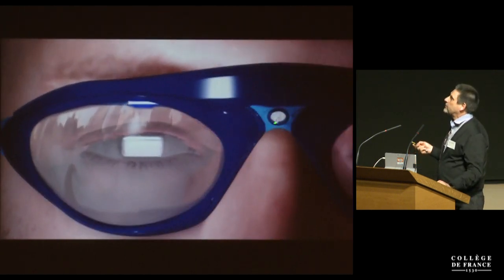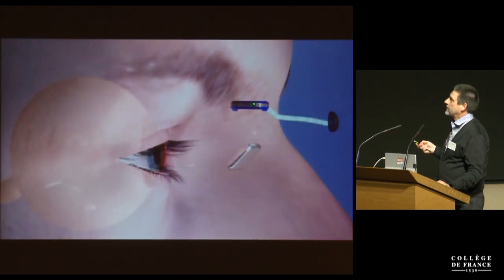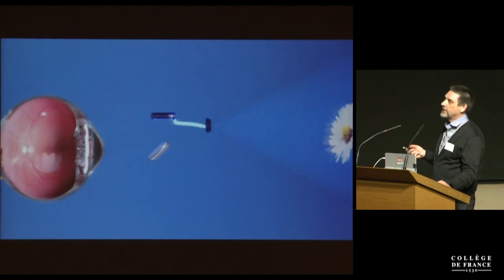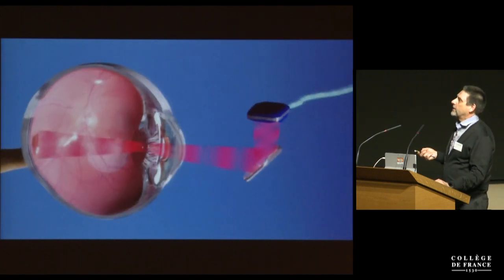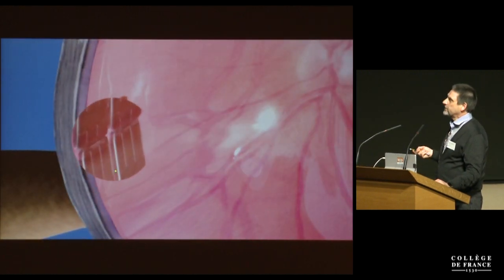And everything else is optical. The image is captured by the camera and delivered via these goggles using pulsed near-infrared light. We use near-infrared light because it's not bright light, and we don't want to overwhelm the patient with bright light because they still have photoreceptors preserved outside this area. The image is projected with pulsed light and converted into current in each pixel. Current flows from one electrode to another in the pixel and stimulates bipolar cells. They talk to ganglion cells, and this goes to the brain.